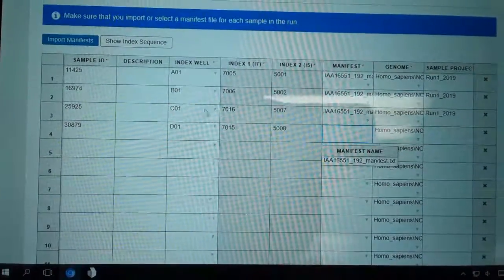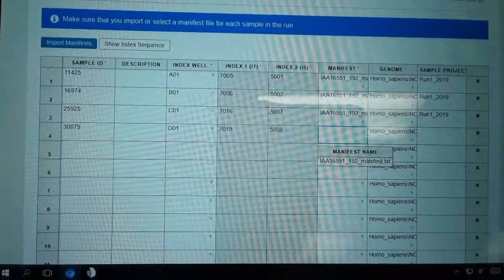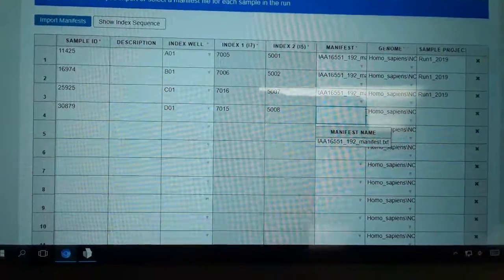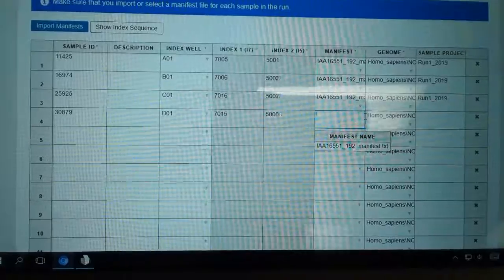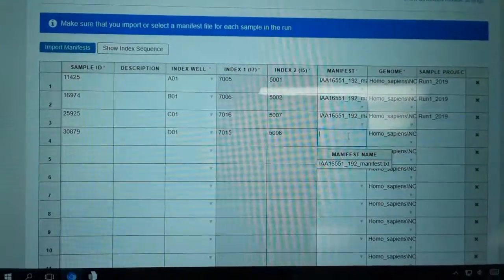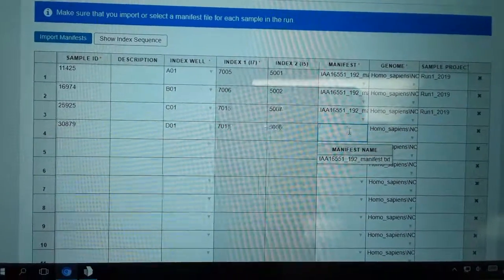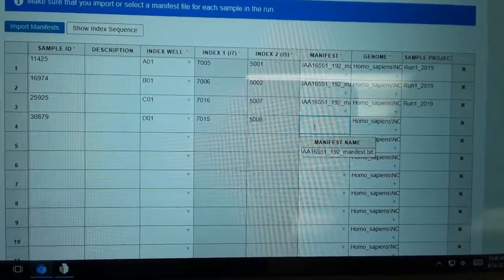This is just basically putting in samples that are going to be analyzed. We've actually sequenced these samples already, about 16 samples. It's an 8-gene panel, AmpliSeq panel for orphan pediatric retinal diseases that we're sequencing the genes for.